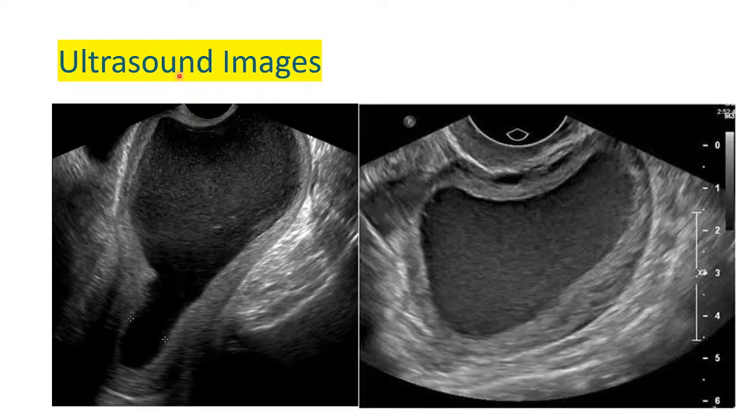So this is the endometrial cavity. You can see here that the endometrial cavity is distended and there is some fluid there with low level internal echoes inside. You can see part of the os is also open and distended. In transverse, the endometrial cavity is very much distended and the uterus appears very much enlarged due to the collection in the endometrial cavity.